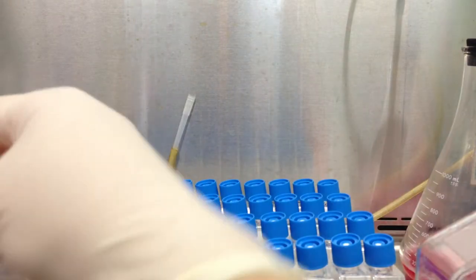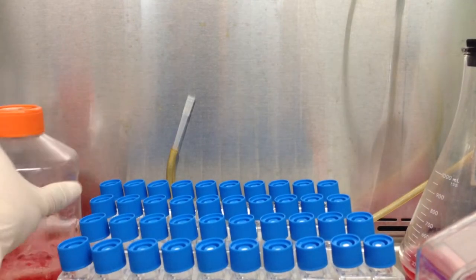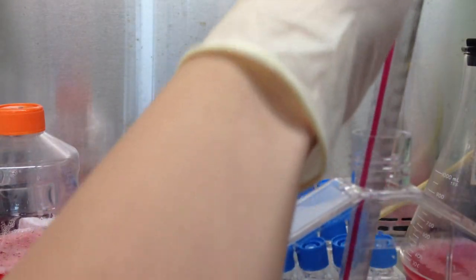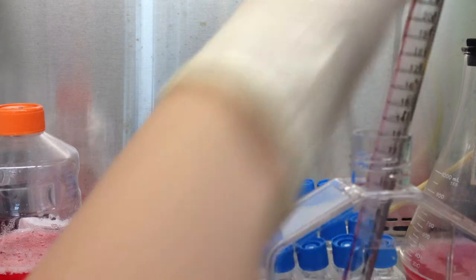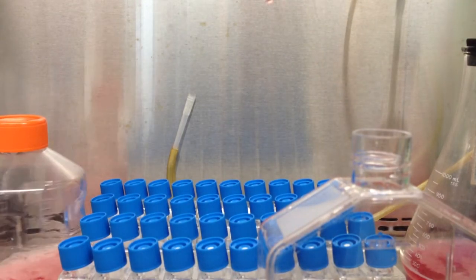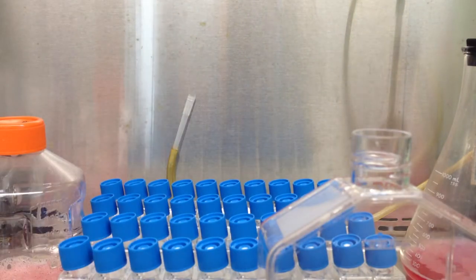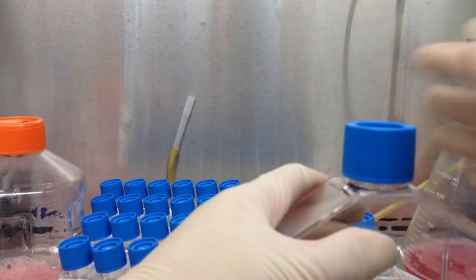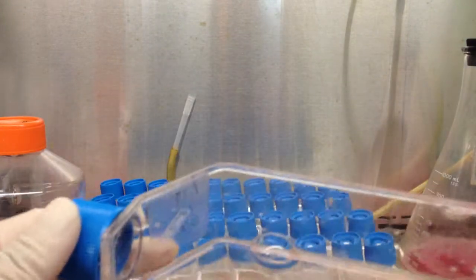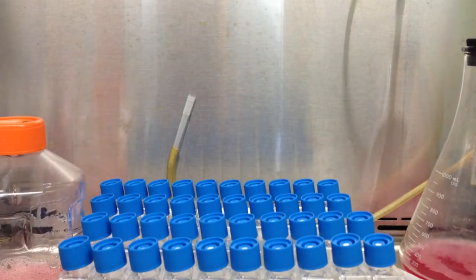I spilled a little, but close the cap on my media, put it aside for now, and then I'm going to put this back into the pipette cover and use it for later, right away. So again, just want to cover it, get the cells off. And now I'm just gonna label.